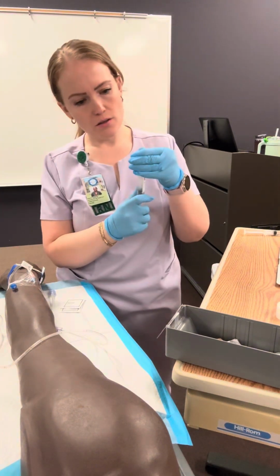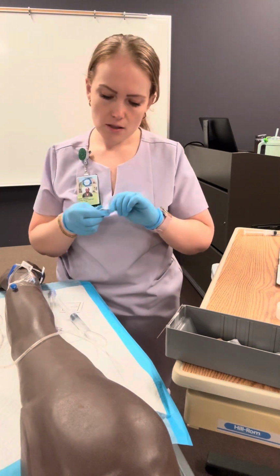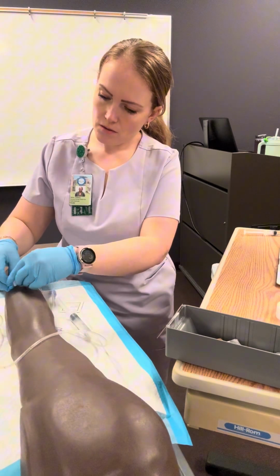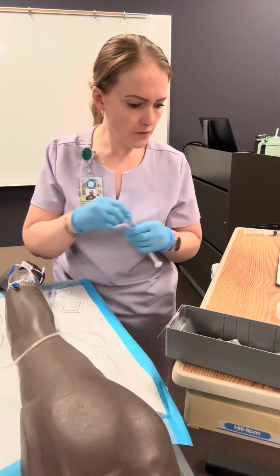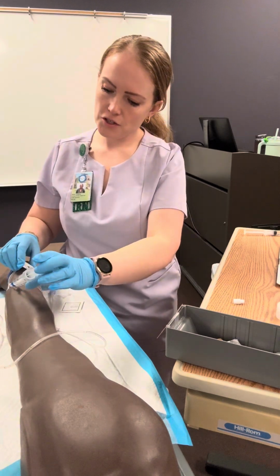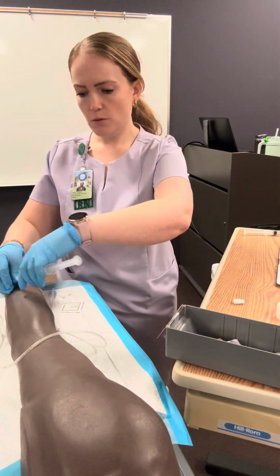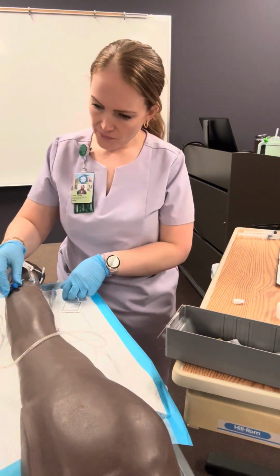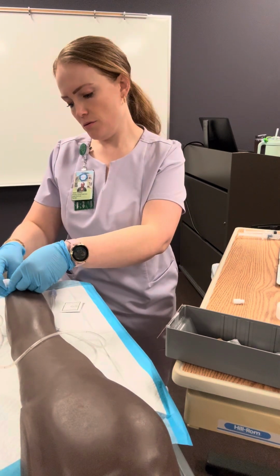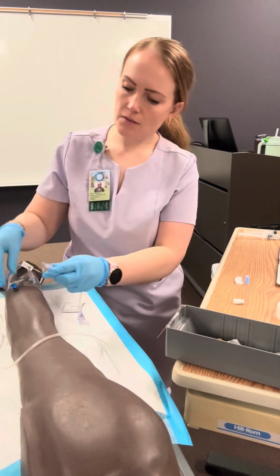So I'm going to make sure I've got my bubble out, and I'm going to scrub here, attach my flush, unclamp, flush, assessing for signs of infiltration and inflammation, clamp it back, remove my flush, and then I'm going to clean it again. And then I'm going to attach my IV tubing here.